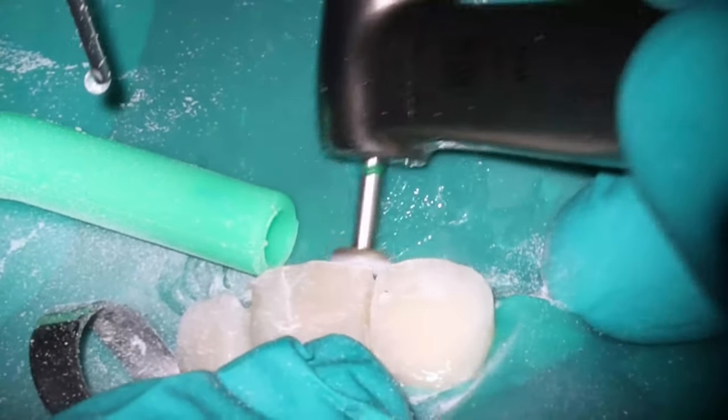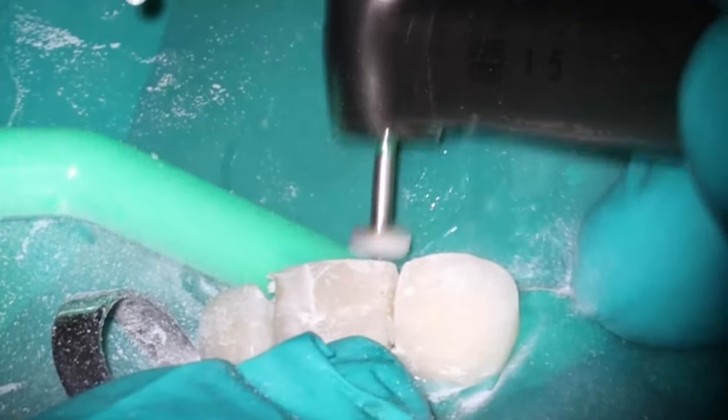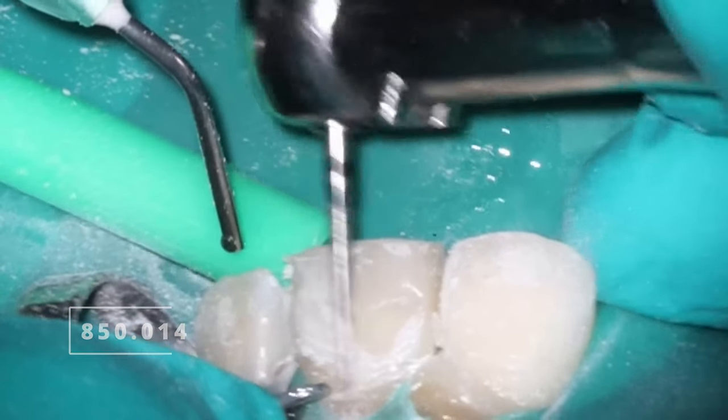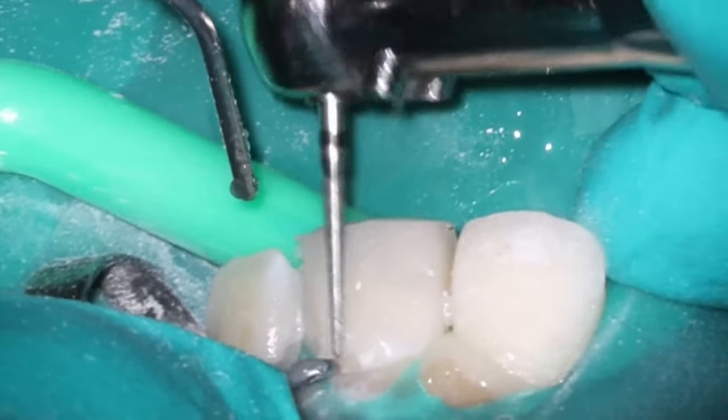So when we are polishing teeth like this, the first thing you want to do is establish those incisal edges. So I'm getting number 9 close to where I want 8 to be. He had also chipped off 8. You can see on the mesial he's got a little bit of a curve there, so I'm going to flatten that out for him, get both of the teeth looking as symmetrical as possible.